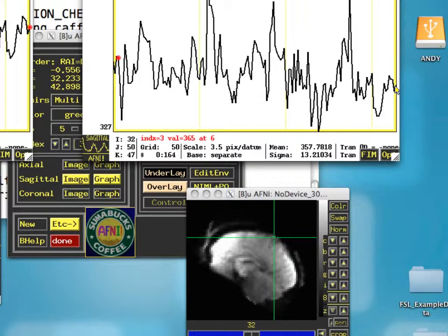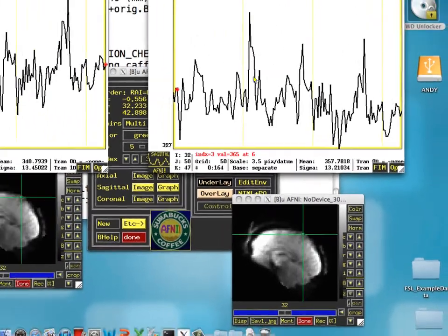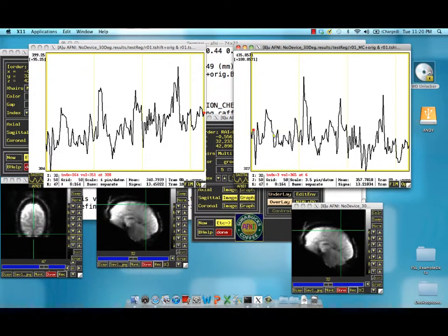And the reason that these values are slightly different in the time course is due to spatial interpolation at these new locations.